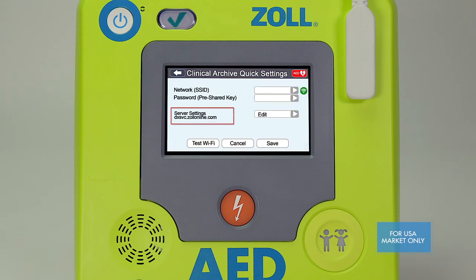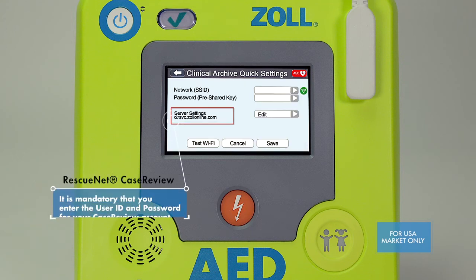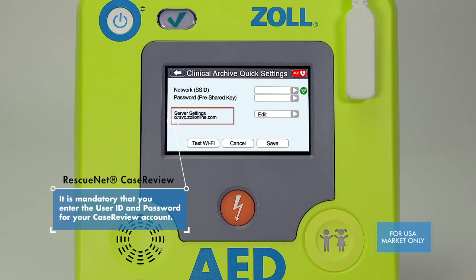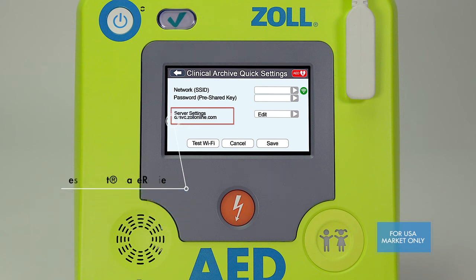The server settings portion of this screen should not be altered. This is the IP address that the data will be transmitted to. The default setting is for case review and transmits data to your case review account through Zoll data.